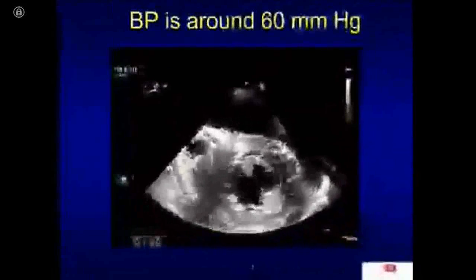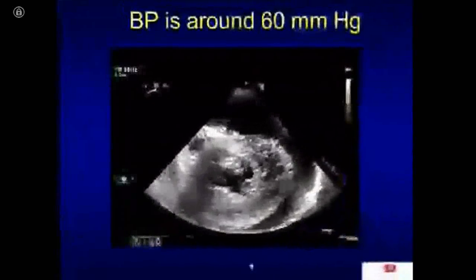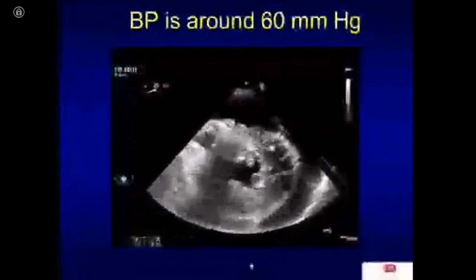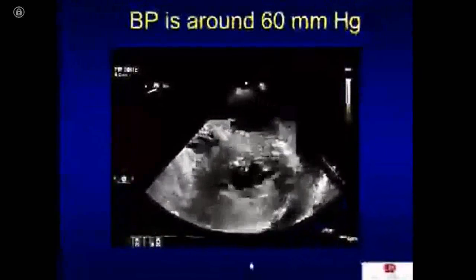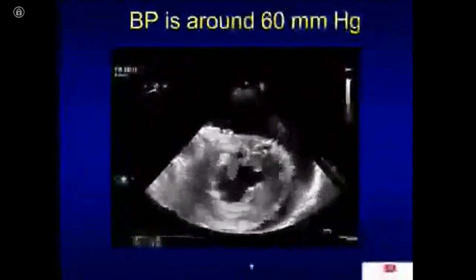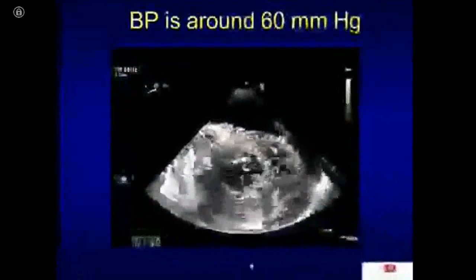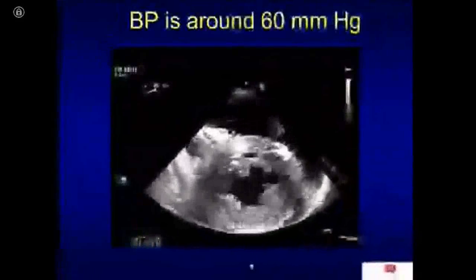So my first thought process is, okay, I've obviously done a transeptal problem. I did a transeptal puncture, and I probably hit the posterior wall, or I must have done something wrong because I gave heparin and I did a transeptal. This is a left atrial wall, so I said, okay, let's get a pericardiocentesis done. So we started doing a pericardiocentesis, and then I reversed the heparin, and so we drew out, and normally what I do is I draw the blood and give the blood back.